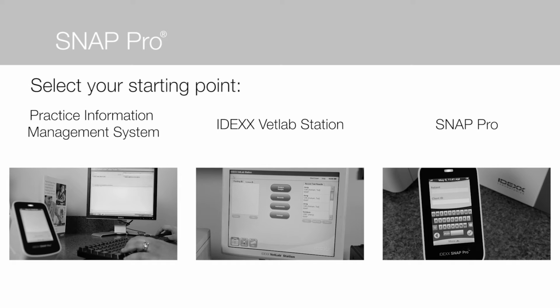There are 3 ways that you can begin your snap run using the Snap Pro: by requesting your snap test at the Practice Information Management System, by requesting your snap test at the IDEX Vet Lab Station, or by selecting New Patient on the Snap Pro. Let's look at each of the 3 ways to help determine the best workflow for your practice.